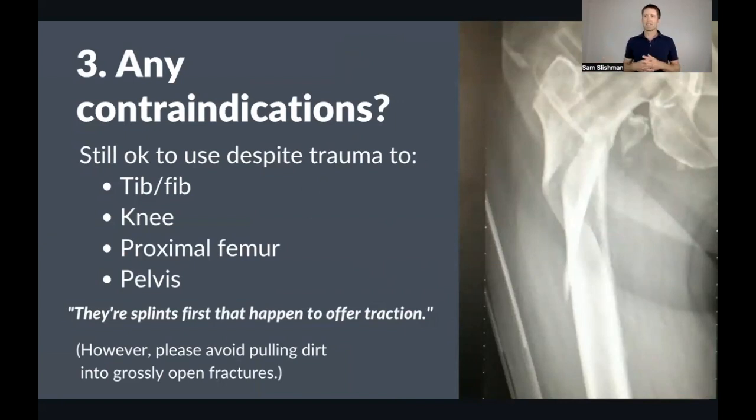So if somebody says, I think I broke my leg, do you need more than that to splint them? And I think no, I think you can apply these and give some stability. Traction is the gravy, the bonus. So you can pull a little bit of traction. Does that feel better? If they say they feel better, what's the problem?